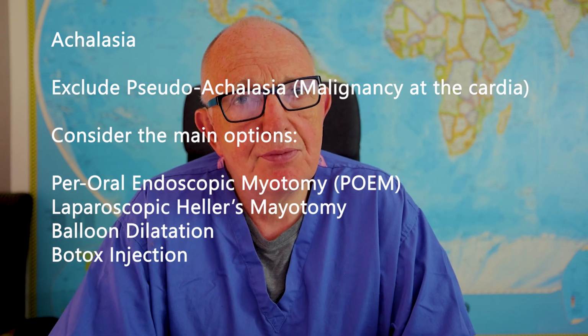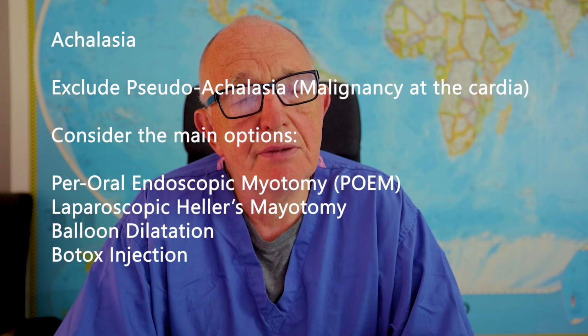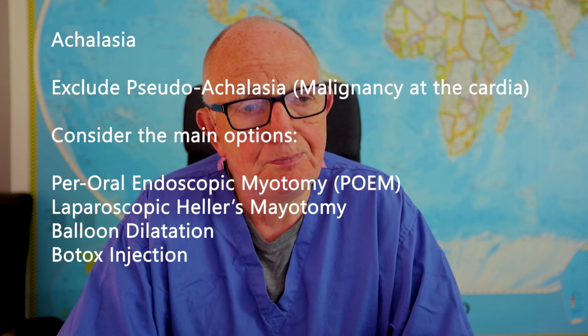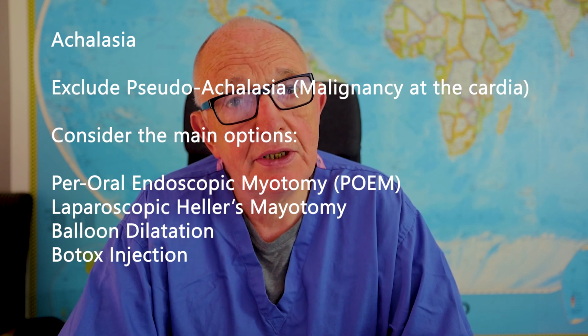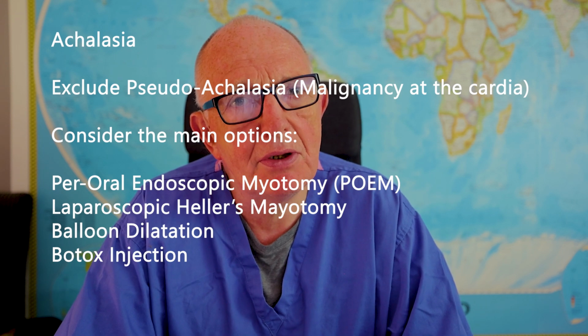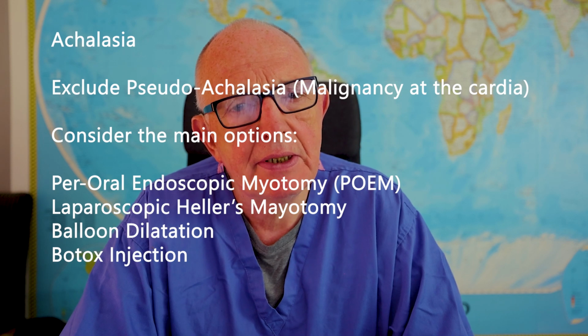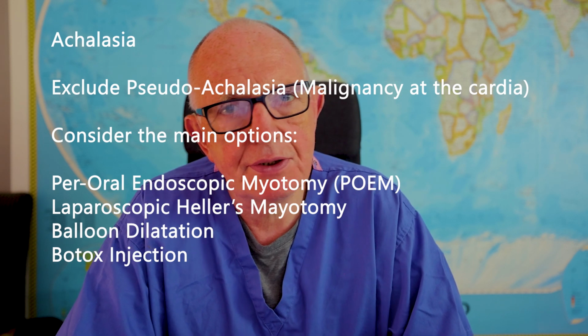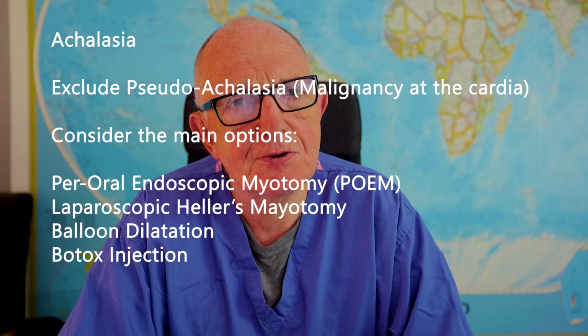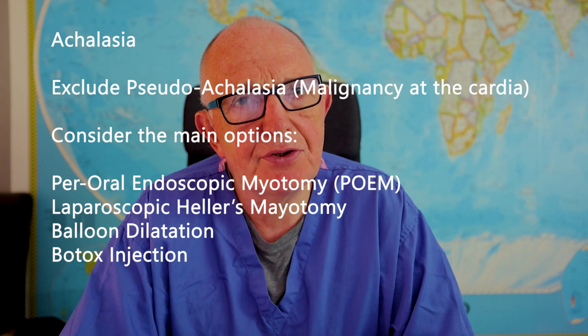Going on to achalasia, that is a slightly different process. It's one of a number of options now in the management of achalasia, but it's still done in a proportion of patients, although it is less well controlled than POEM or laparoscopic helismyotomy, but obviously it has a place in a proportion of patients.